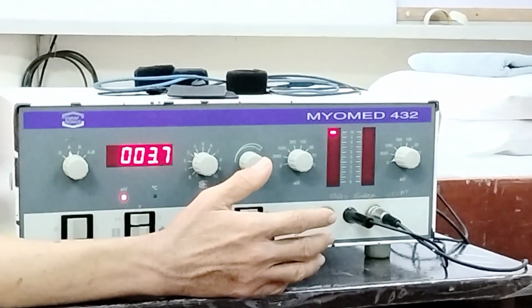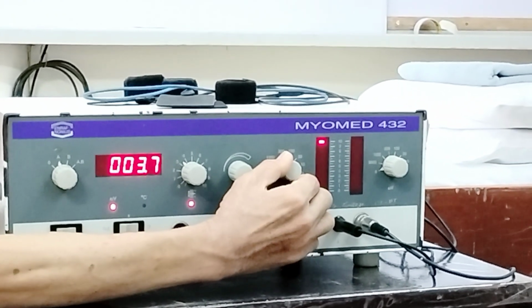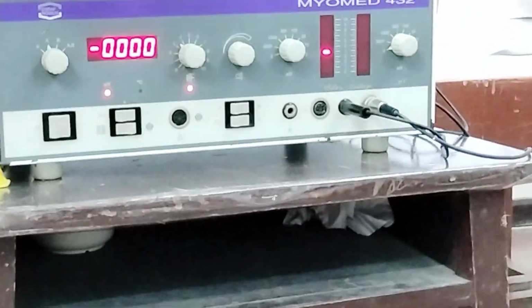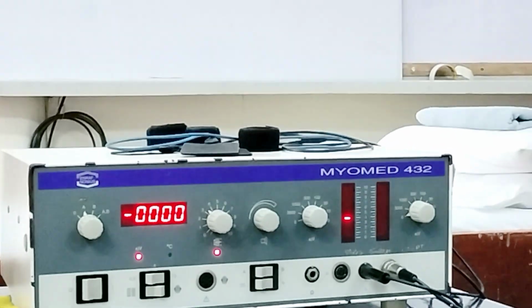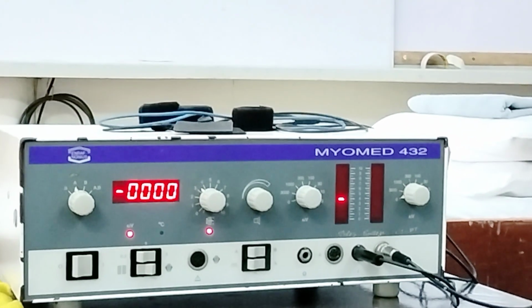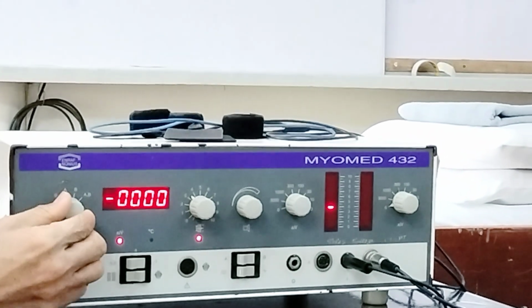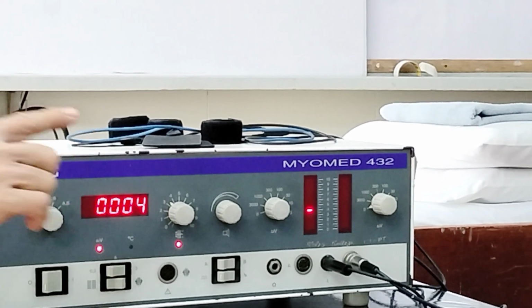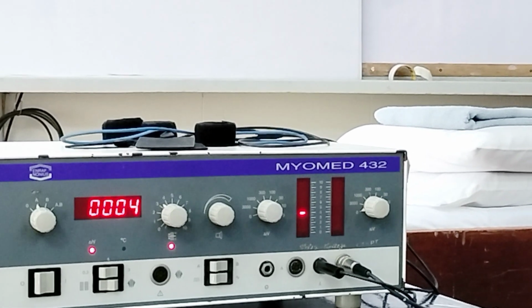Now if we place it at 10, the bar is reduced, right? Where is the bar level now? It's at level 4. So what is 40% of 10? That is 4. So therefore, it registers 4. And you can now see it's 40% of 10 microvolts.